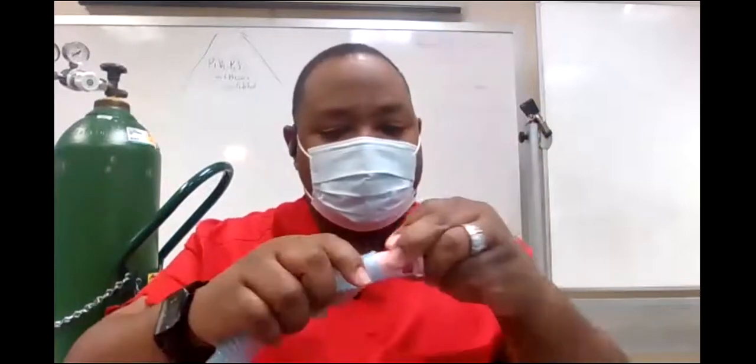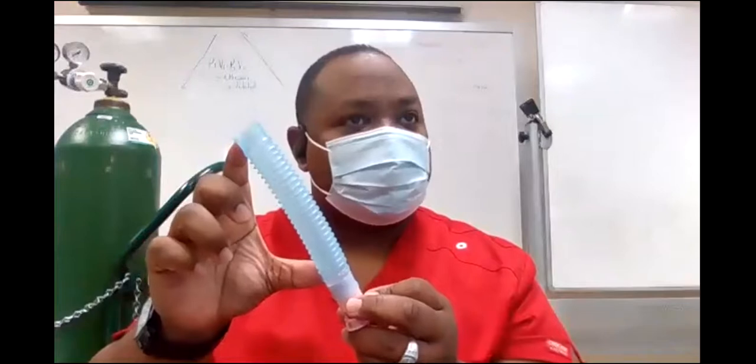And this is easier because it's easier to deal with. So I would take one of these, say I want a patient on a 40% Venturi mask, and I have to make it myself. I don't have these little expensive ones, right? Well, I take the 40% pink one. I put my one section of large bore tubing on here, right?